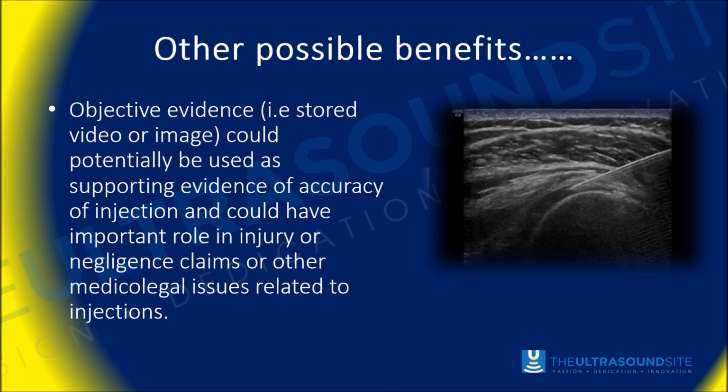In other words, that where the needle was placed conformed with normal practice technique, and this could be really important when there are, for example, claims of damages for injury or negligence claims or other medico-legal issues relating to the injection.